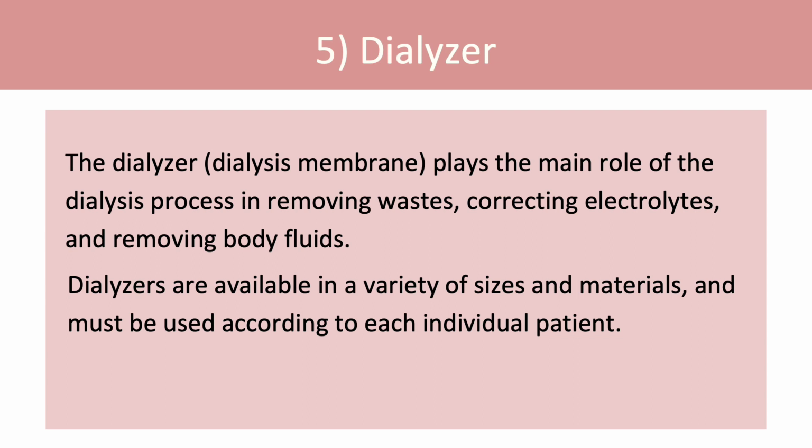The fifth component is the dialyzer. The dialyzer is often referred to as an artificial kidney and plays the main role in removing wastes, correcting electrolytes, and removing excess body fluid. Dialyzers come in a variety of sizes and materials, and must be used according to each individual patient.